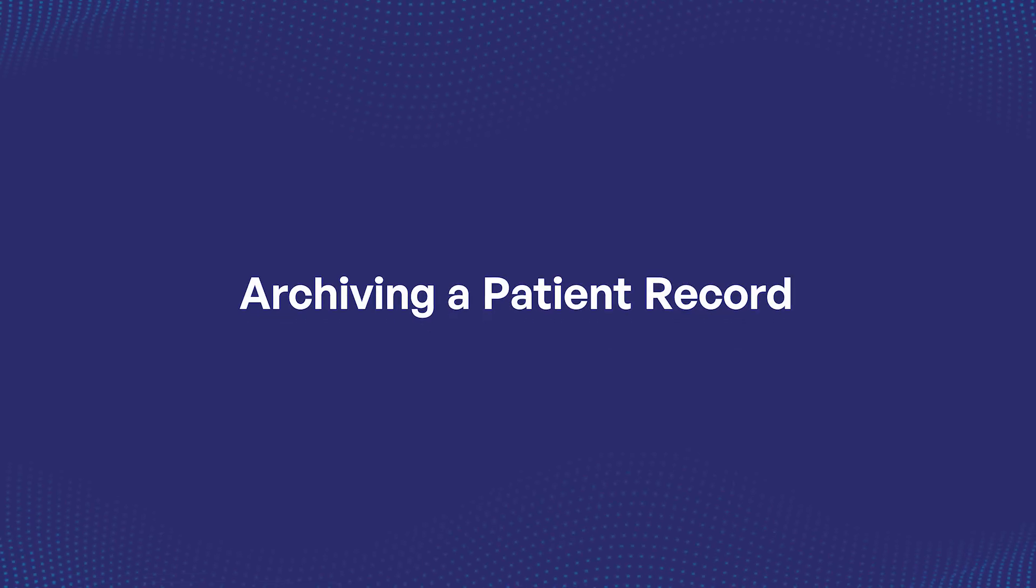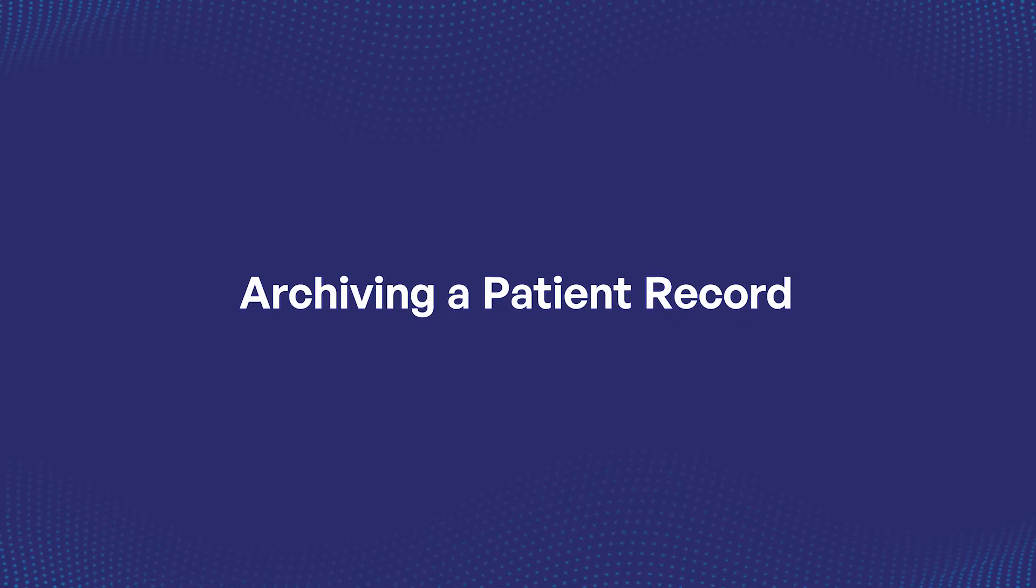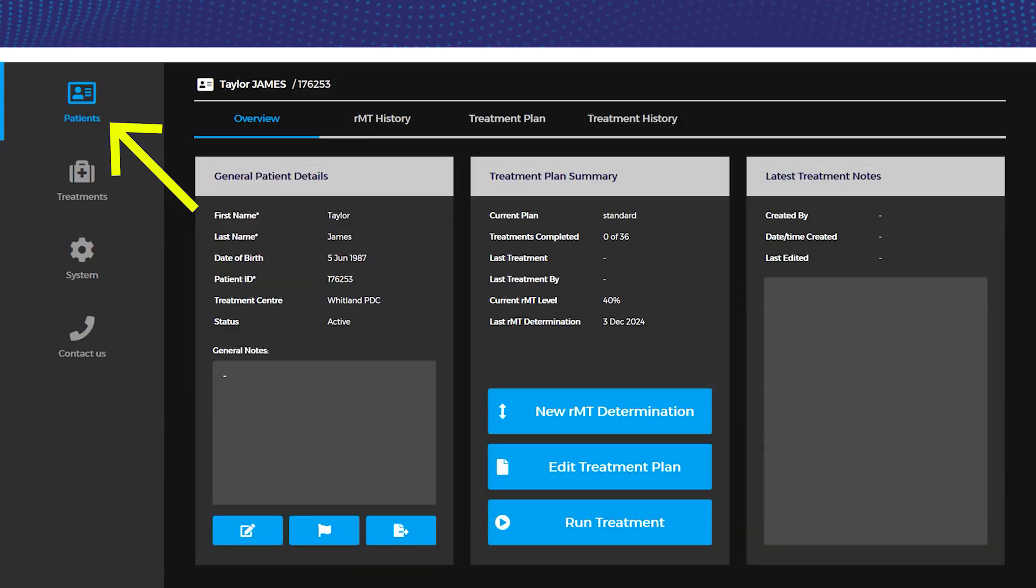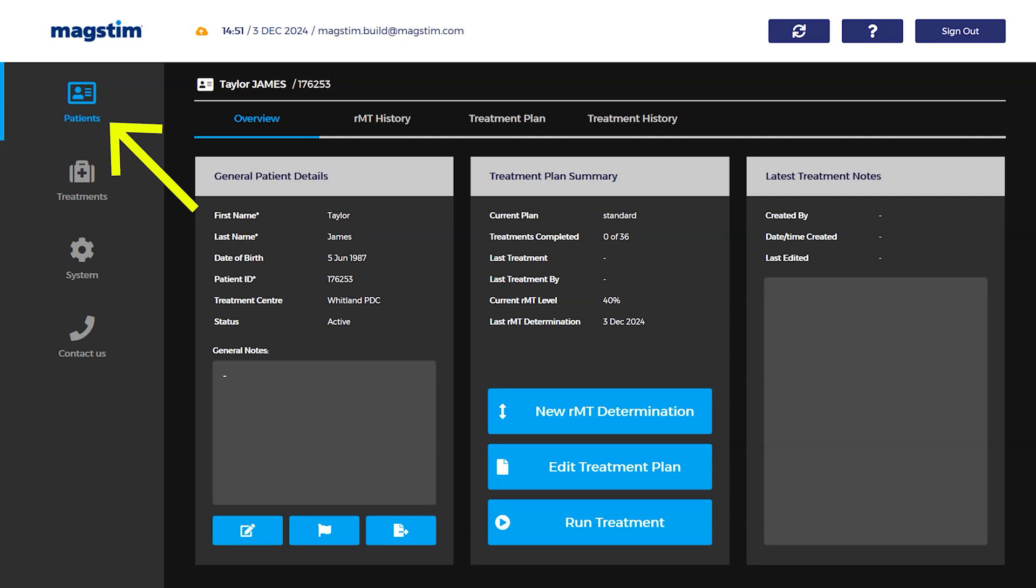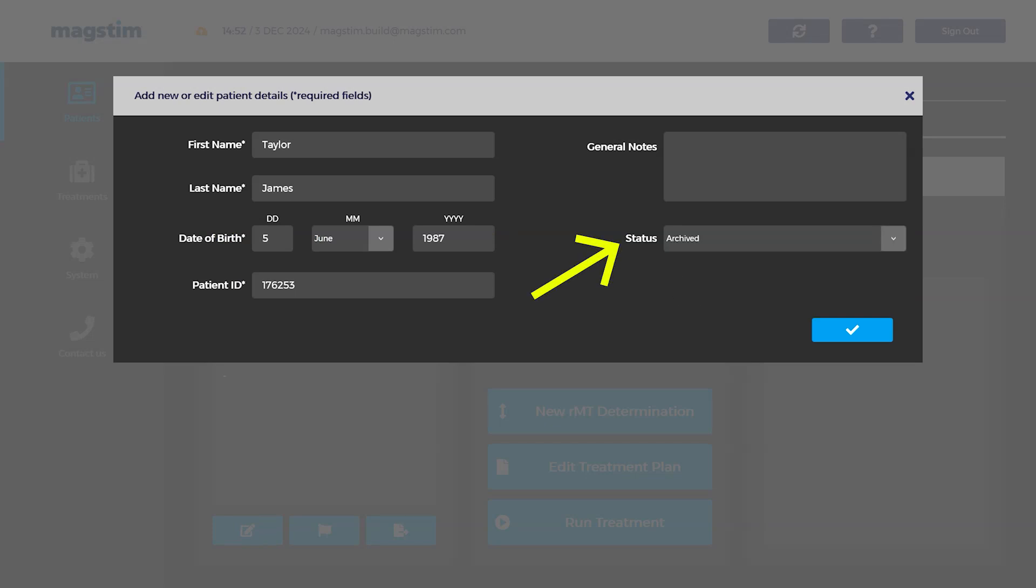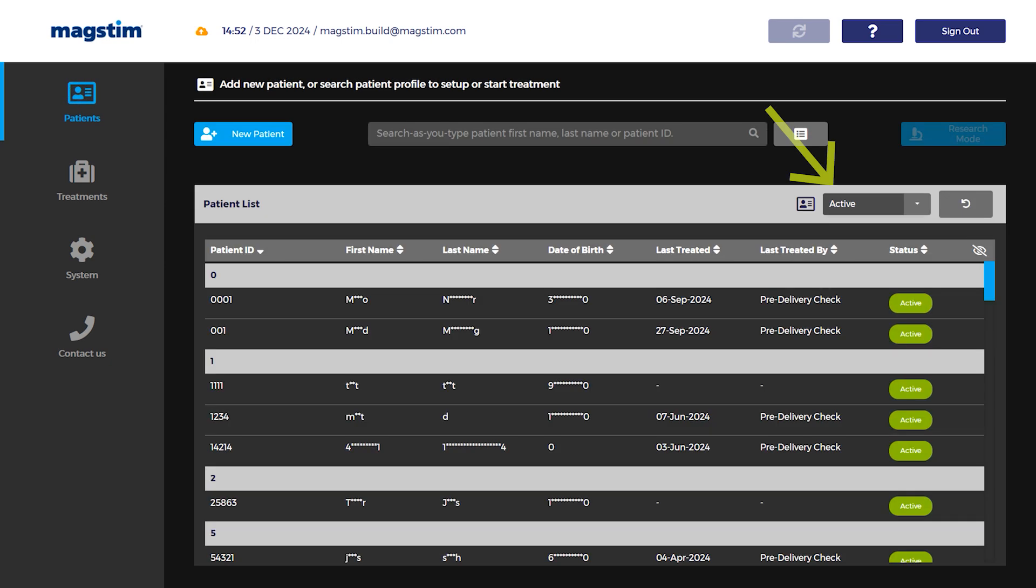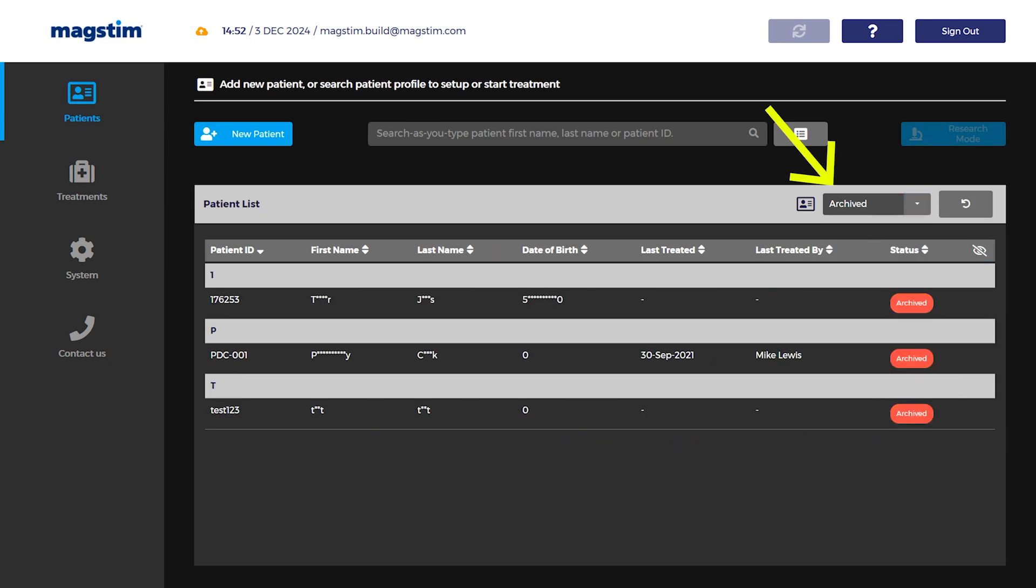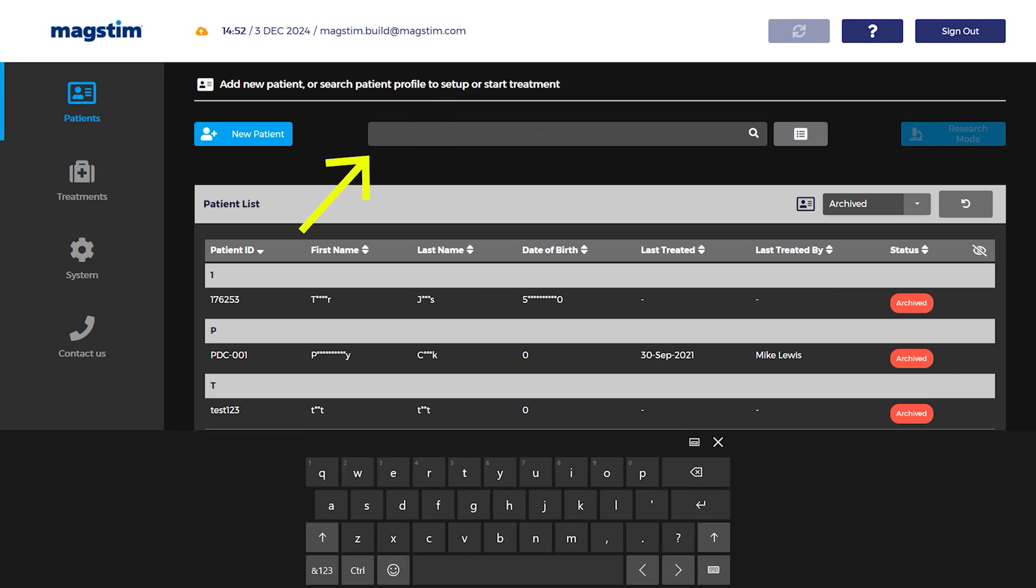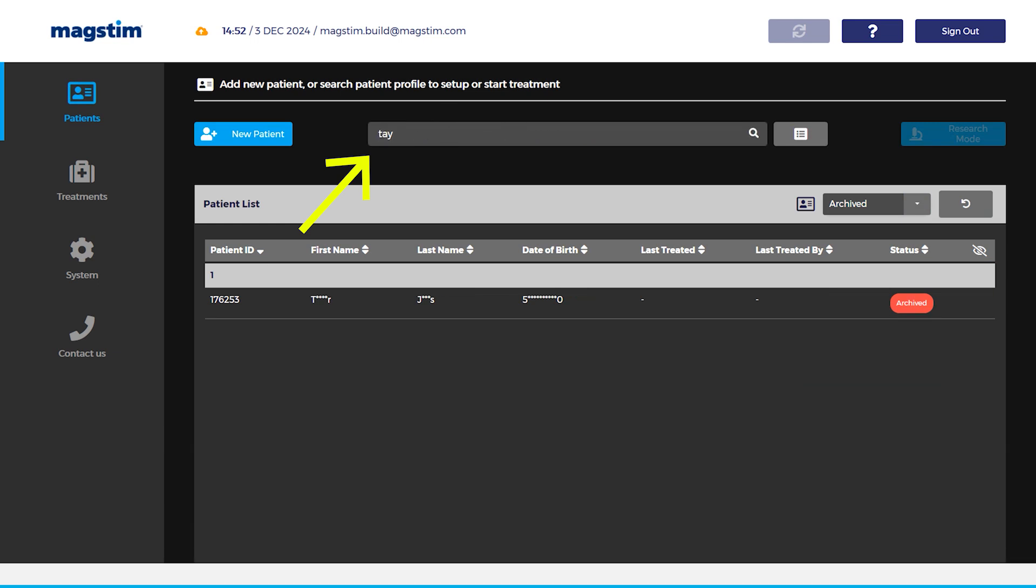Archiving a patient record: Open the patient record and select the edit icon from the overview page. On the add or edit patient details window, select archive from the status drop-down list. The patient record will be archived, but not deleted. To retrieve the patient record, select either the archived or all filter on the patient database and search for the patient record using first name, last name, or patient ID.